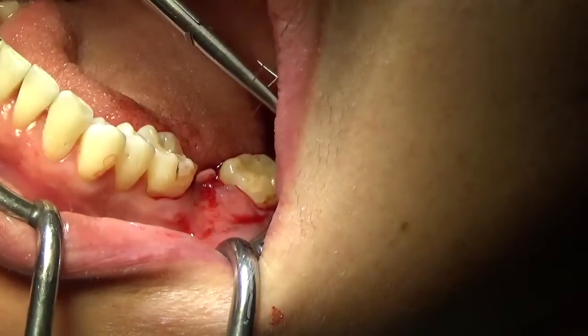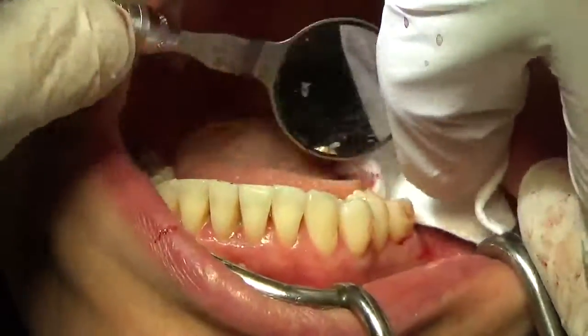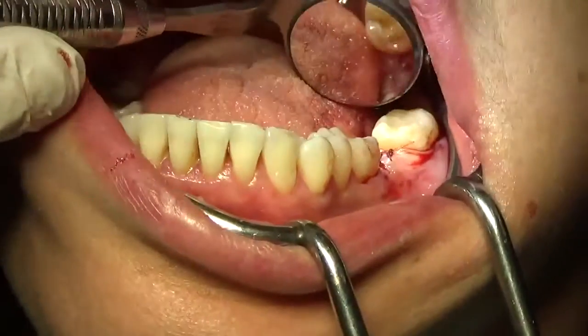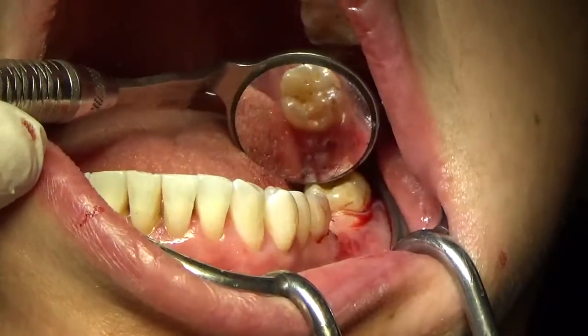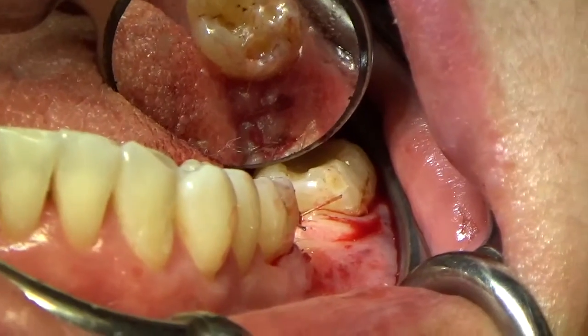This is 4.0 chromic gut. Okay, simple interrupted sutures here. Clean it all off. See there? So, it's closed. It's not that overlapping praying hands type closure, but that's closed well enough there.